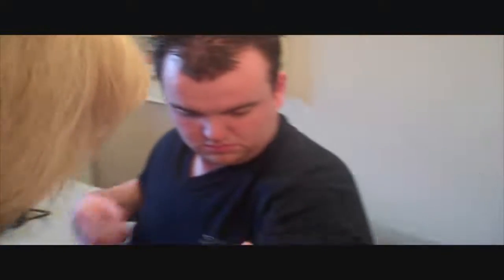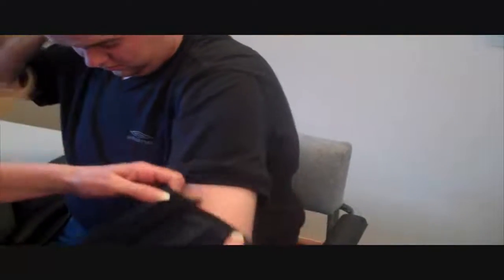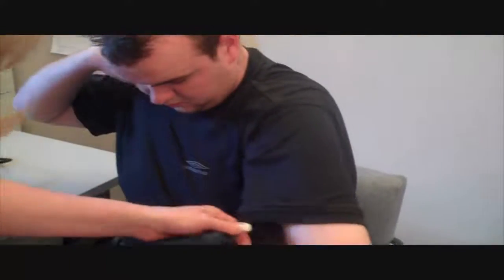So just take that off. I'm going to loop that through again.